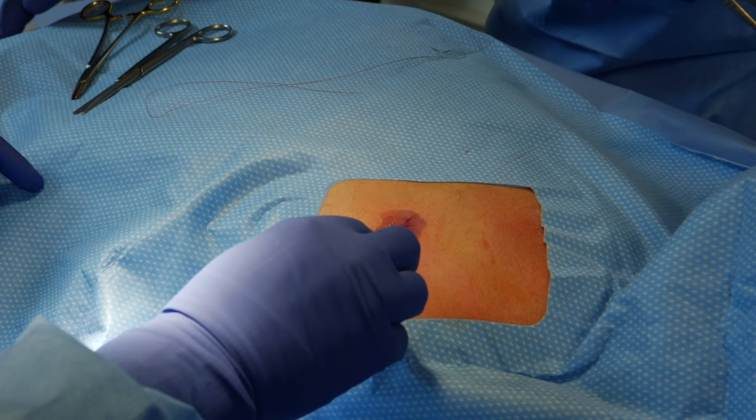There's the drop of surgical glue about the size of a quarter — that'll dry immediately and the patient can shower tonight. That'll peel off in about a week. There's your implantable loop recorder, brand new technology from St. Jude.